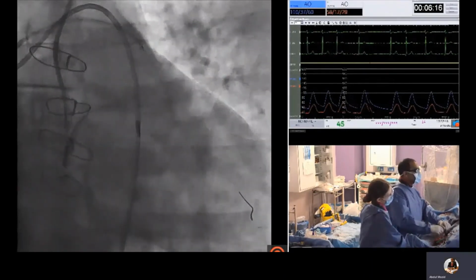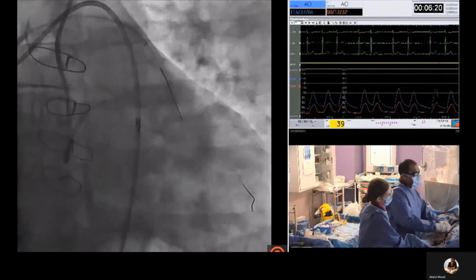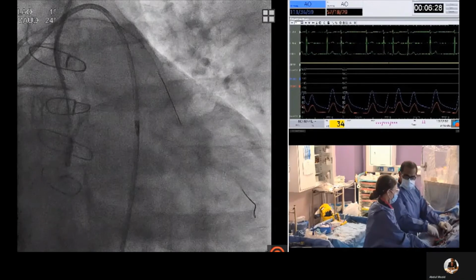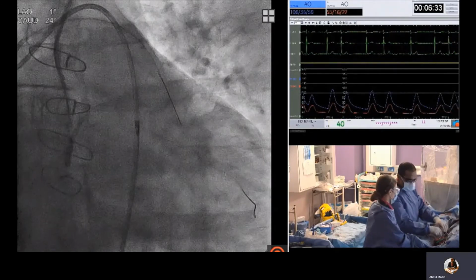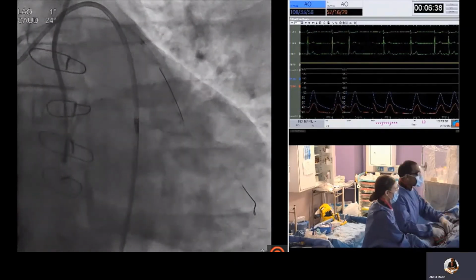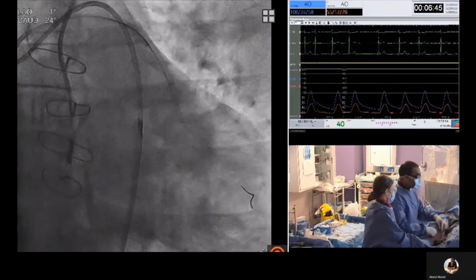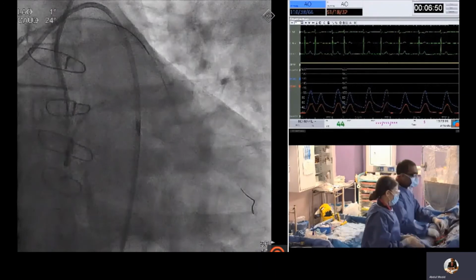And then simply advance the wire through the body of the microcatheter into the graft. And you can advance the wire a fair good distance to give you support, and actually you can maintain adequate support from this technique as compared to having an externalized wire, which is the best form of support.